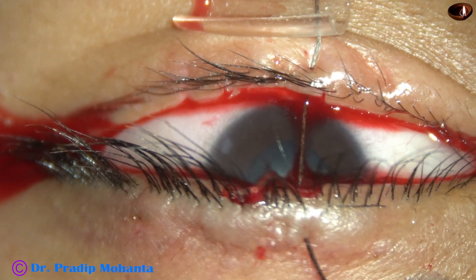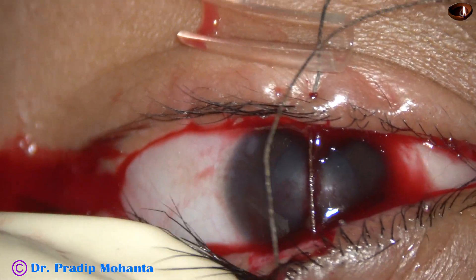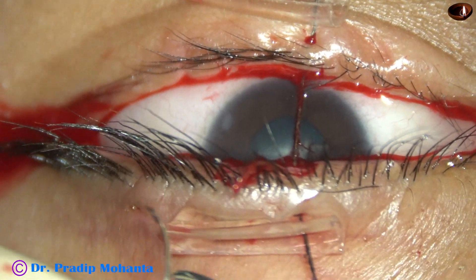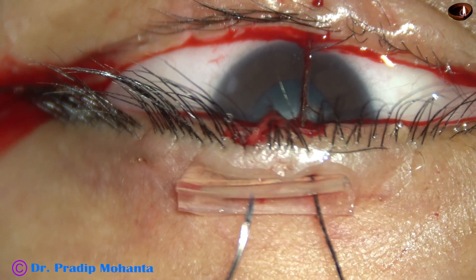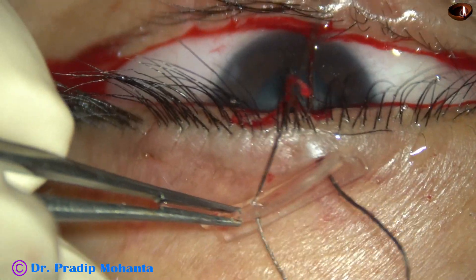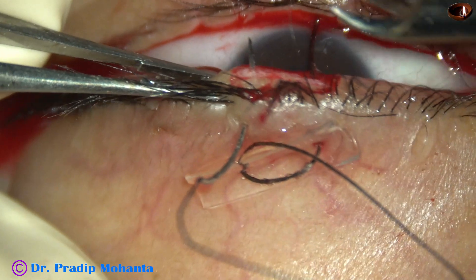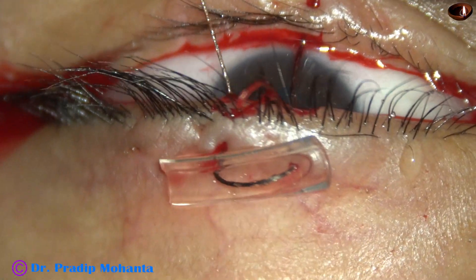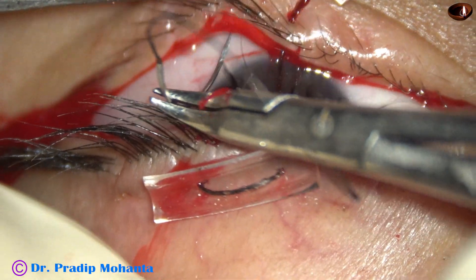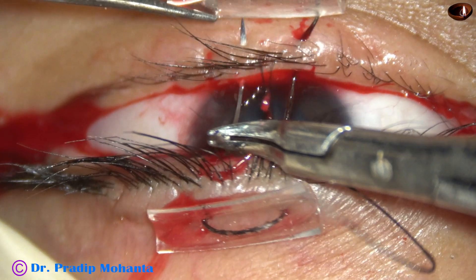You can see the drip set tube. Another bite is taken. Now the bite is taken on the upper lid, then the bite goes through the lower lid, and then through the supporting drip set tube.